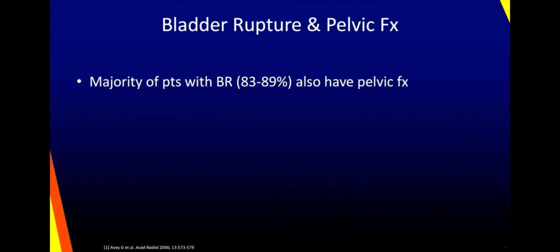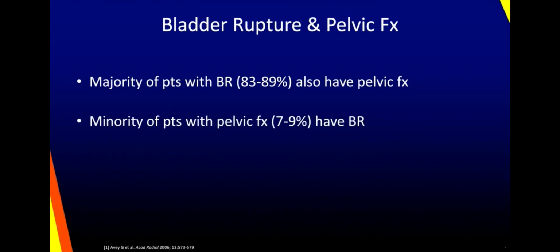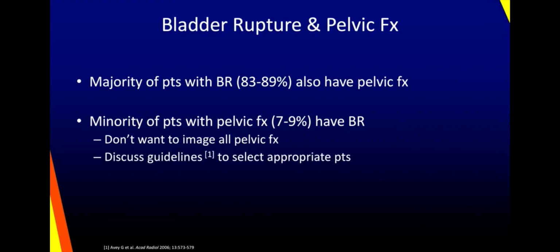The majority of patients with bladder ruptures also have pelvic fractures. Only a minority of patients with pelvic fractures have a bladder rupture. And we don't want to image all these patients with pelvic fractures, so we'll discuss some guidelines to select the appropriate patients. Let's look now at the management of bladder trauma.